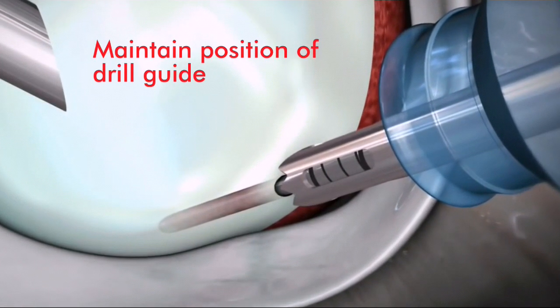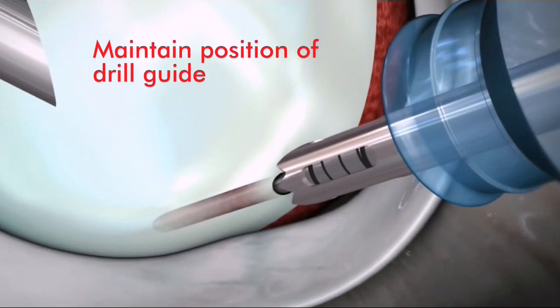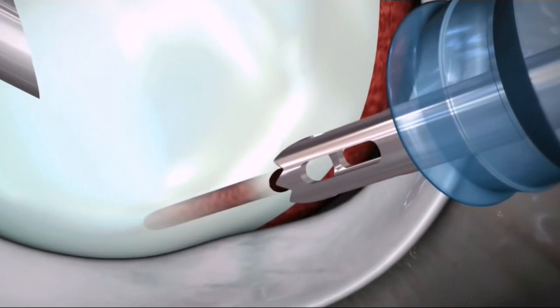While removing the drill bit through the drill guide, it's important to maintain position over the pilot hole with the guide.